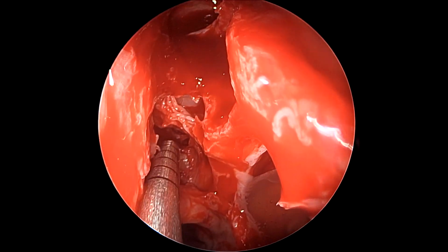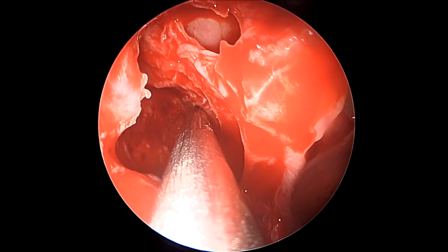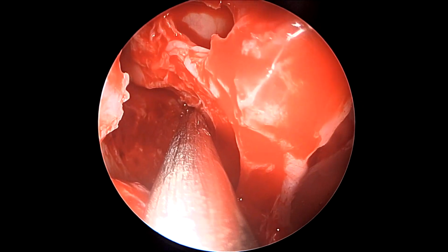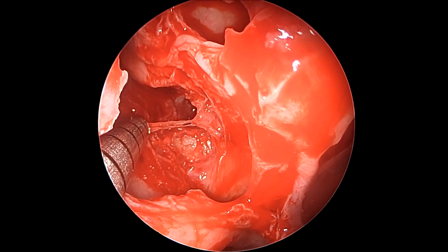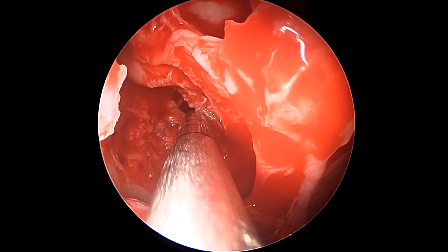And now once that has been opened, subsequently more and more ethmoidal septations will need to be opened. And like I explained initially, the best way to do so would be through an array of either straight or angled through-cut forceps.